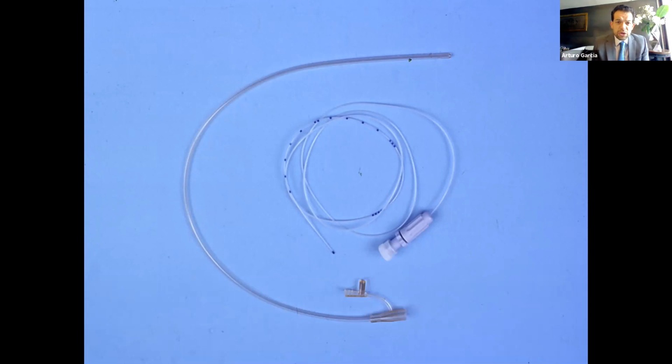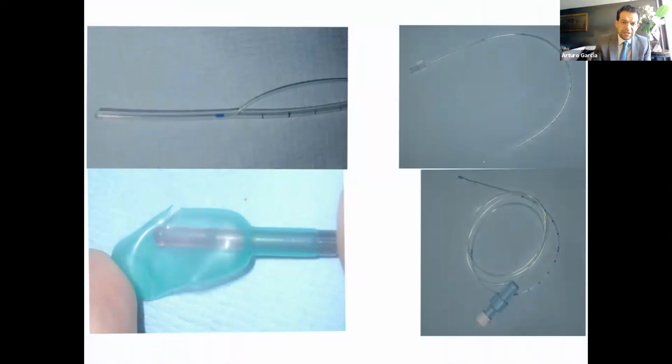But if you don't have this, or it's more convenient for you to use the dual lumen catheter, then it's okay. You always have to use the smallest dual lumen catheter you can. Try to get a 6 or 7 French. This is going to be the most useful thing. Over 8 French, it is not recommended because it is going to interfere with the measurement in pressure flow studies. So this is the way you feed the catheter inside the UPP line. And after you get into the bladder, you dislodge this from the rest of the catheter and you can carry on with the test.